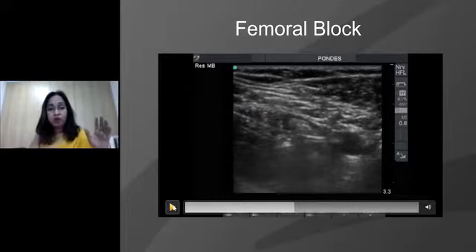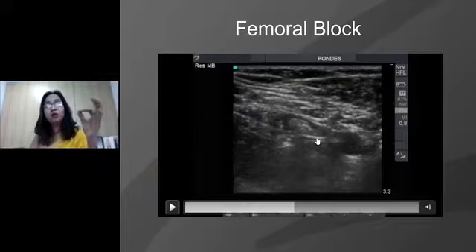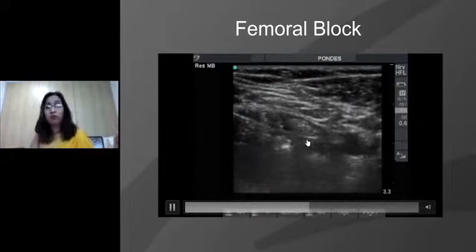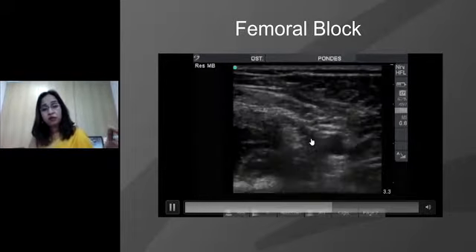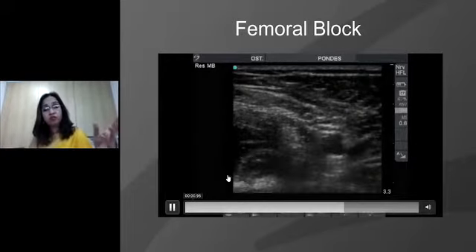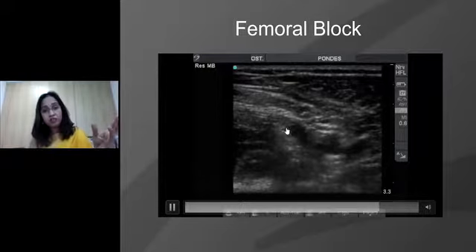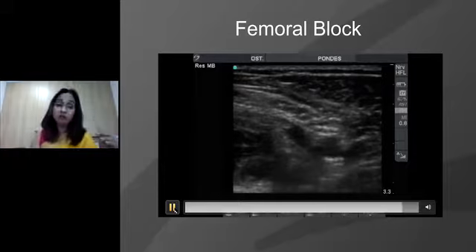I mean the needle. Now, what I'm trying to show you is we have just inserted a catheter with a Tuohy needle. So instead of a nerve stimulating needle or any short bevel needle, if we can put in a Tuohy needle and give a continuous femoral block here, well, it works. And now put in a catheter and don't thread it much. Remove the Tuohy needle, tunnel it, and this is the catheter, you can see the catheter here, and if you inject the drug through that, you will see some hydrodissection happening due to the drug which has come through the catheter.